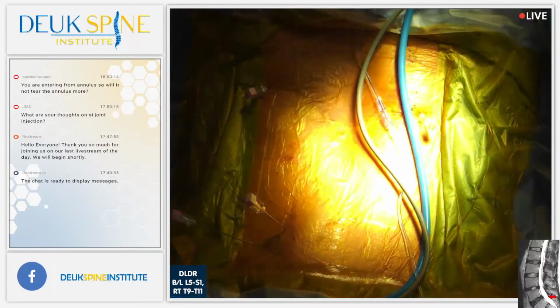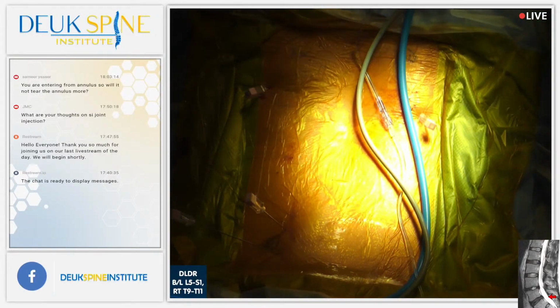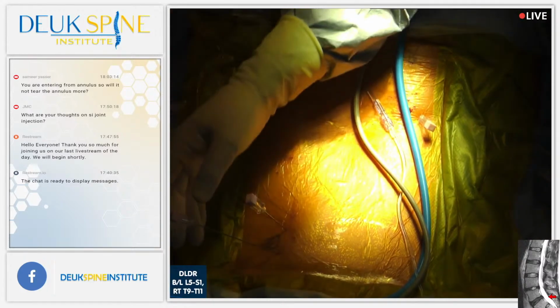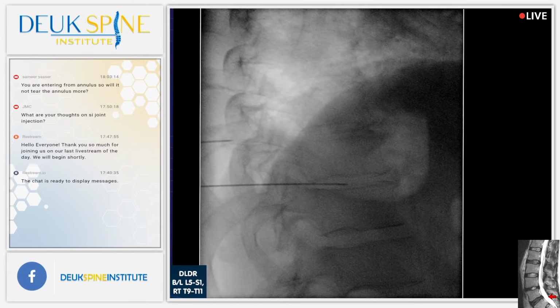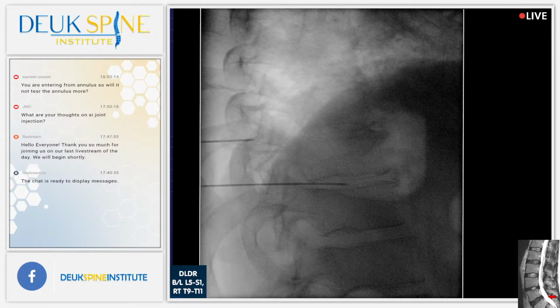Shot. Shot. That looks pretty good, right, Luis? It's lined up nicely. Shot. There's bone. Shot. Right on the facet.